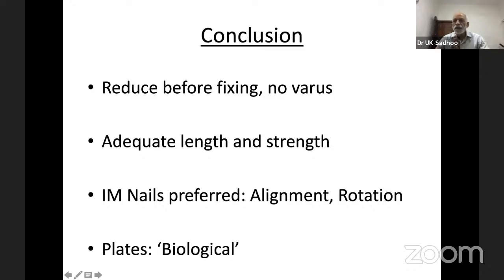And the chisel, once you have advanced from the near fragment, that is the cortex close to you, into the distal fragment, make sure it stays in the center of the fragment in the lateral view, and in the AP in the center, but preferably slightly below, infero-medial to the center. That's where you get the maximum hold, and then you have a mile of bone before the implant will ever cut through, provided you have not reduced it in varus, when the blade will break in varus.